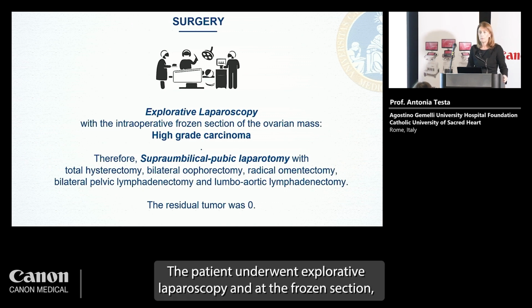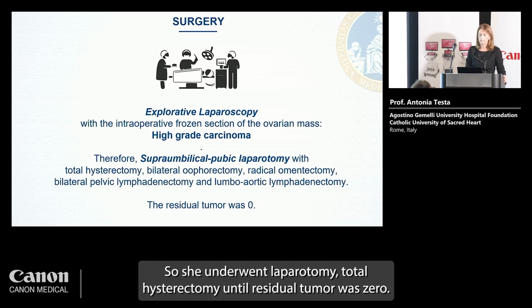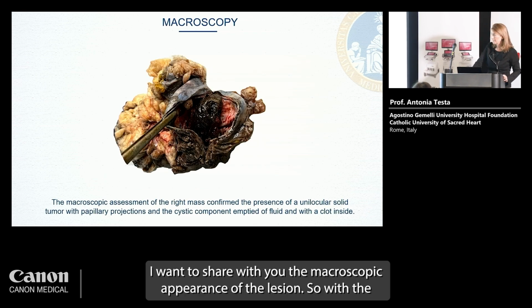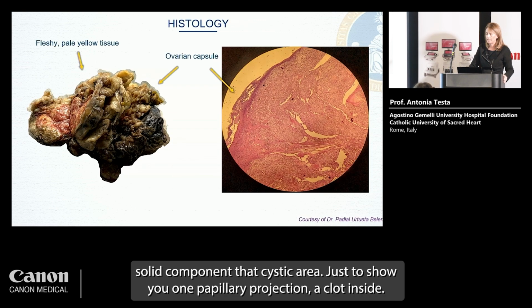The patient underwent explorative laparoscopy and at frozen section, high-grade carcinoma was diagnosed. So she underwent laparotomy, total hysterectomy, until residual tumor 0. I want to share with you the macroscopic appearance of the lesion, with the solid component, that cystic area, just to show you one papillary projection, a clot inside.